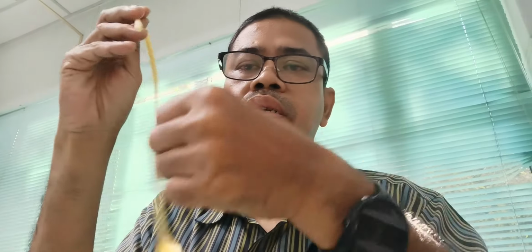Alright, after that you have to lubricate the external urethral meatus using lidocaine, or you can just use lidocaine gel and lubricate it. If the patient is aware, alert, you wait sometimes like 5 minutes, for example, and then insert. Okay, when you insert through the external urethral meatus, you have to hold it upright like this, 90 degrees, and you insert it.